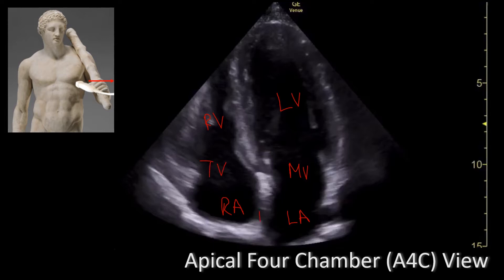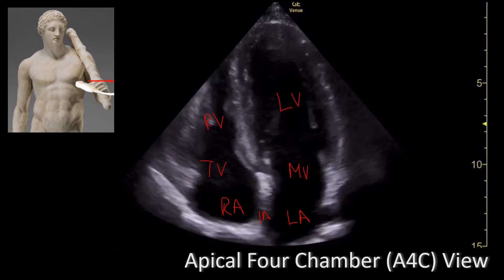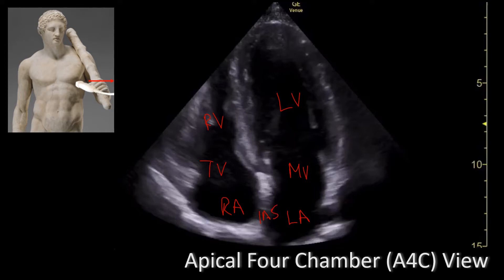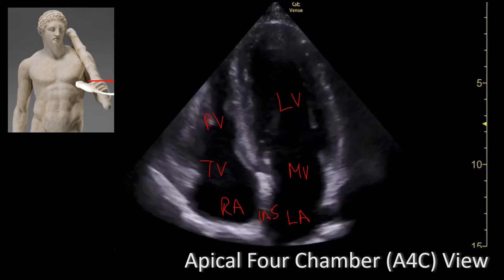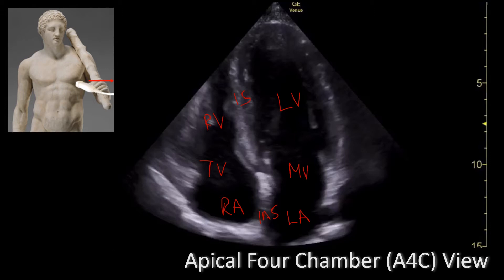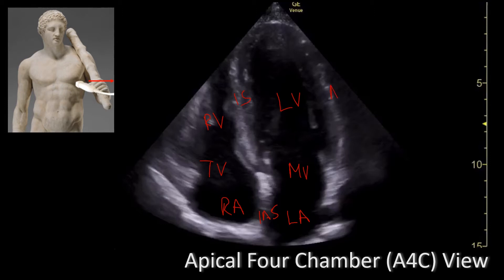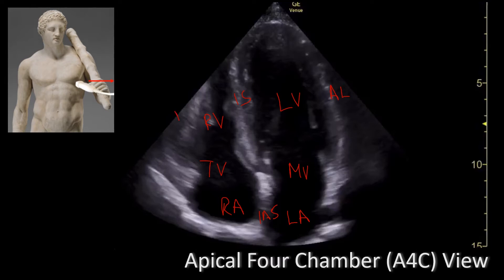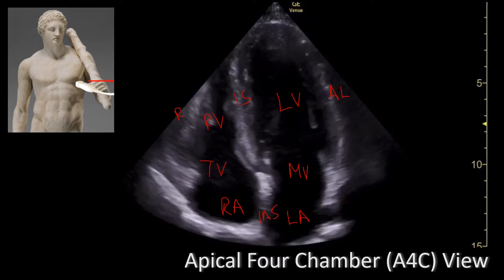The interatrial septum will be between the right atrium and the left atrium. Note that in this particular case, because of the angle that the ultrasound beam slices the heart, this part of the septum will be the inferoseptal wall, and the part of the lateral wall of the left ventricle will be the anterolateral wall. On the right ventricle, you have the right ventricular free wall or the lateral wall.